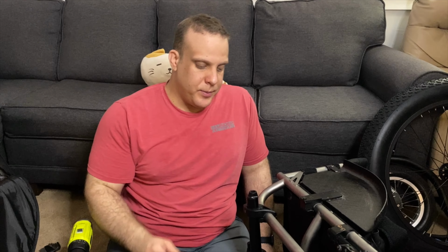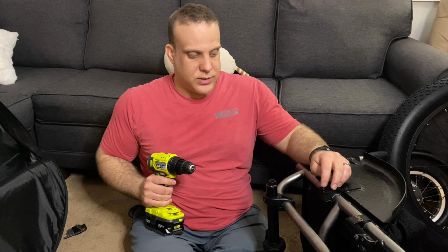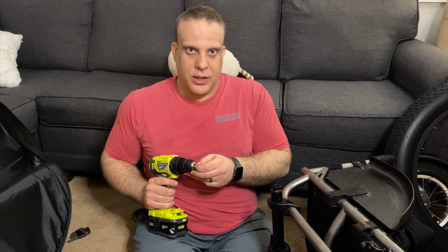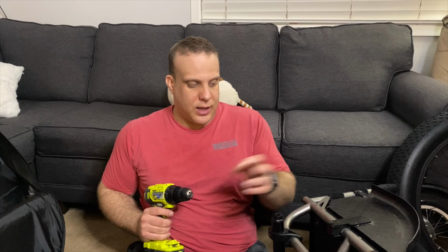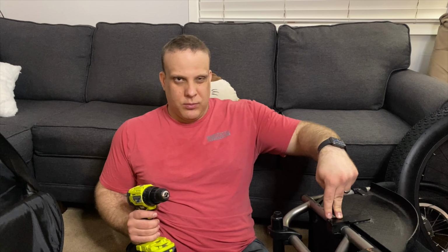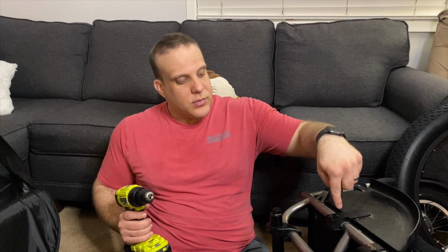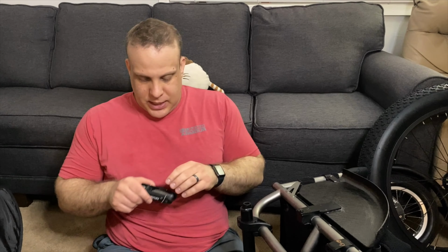What I did in this situation was use a little bit of WD-40 to loosen the stuck bolt. I got the power tool out, and the Allen wrench screw was a little bit rounded out, so I used a different bit on my power drill that grabbed a little bit more. Also, because I know there are springs behind these screws that help squeeze this side guard, I tightened the top one to hopefully relieve some pressure off this screw, and we got it out now. So the one that was stuck is loose, and now I'll just hand loosen the top one, and we'll get back to what I was going to show you.